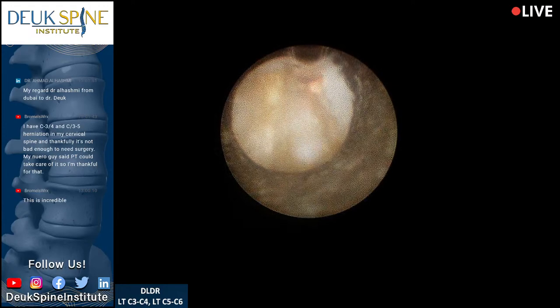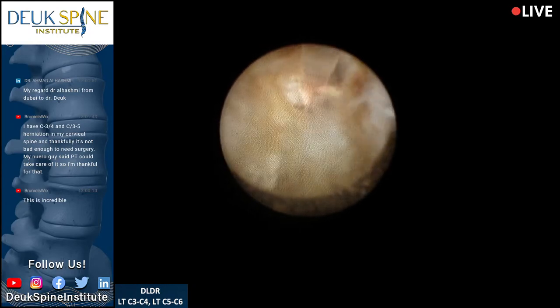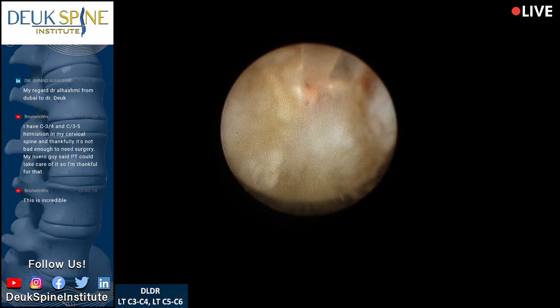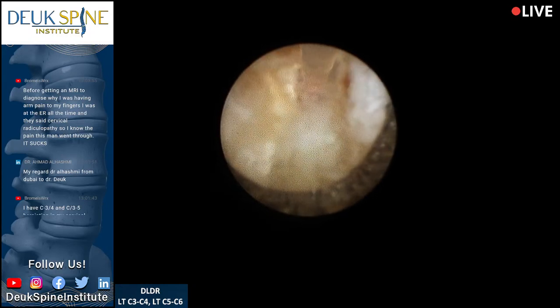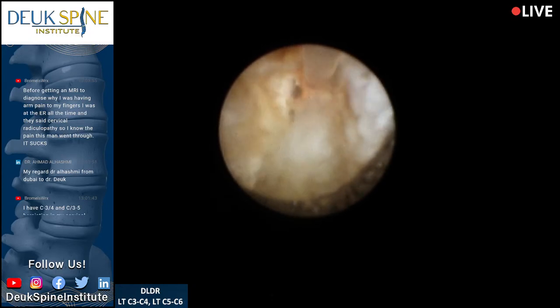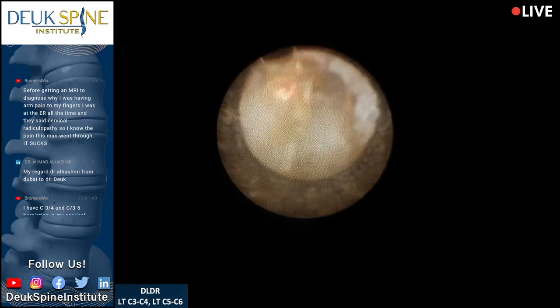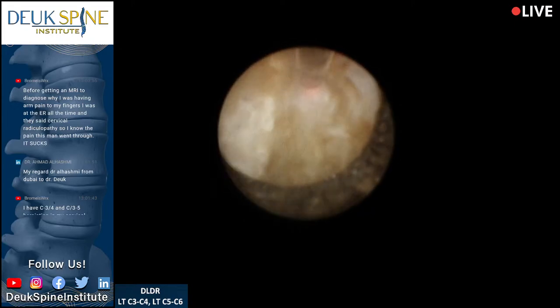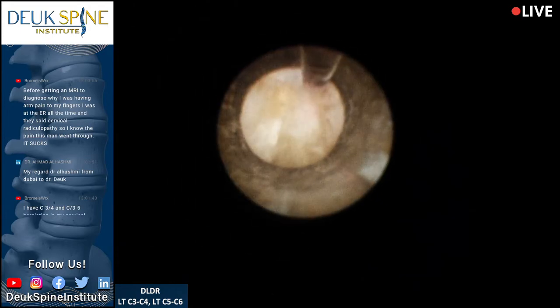That's the foramen — you're seeing the foramen right now. Spine surgeons doing cervical surgery don't see this because there's no tool that allows you to see inside the foramen except a very expensive microscope, and even then you can't have this view. Luis has done many microscopic surgeries with me — you never have this good a view of the foramen. We're literally peeling herniation off the top of the nerve root in the foramen.